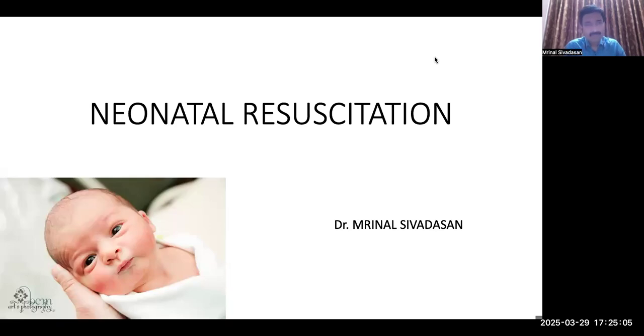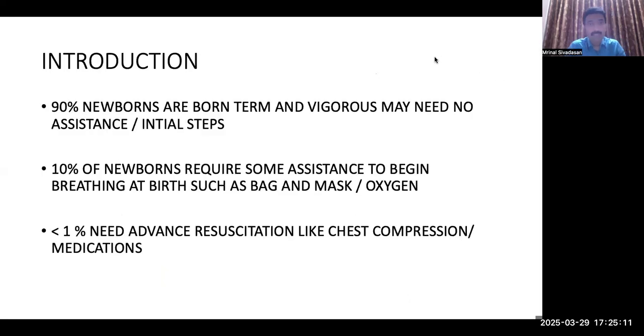Hi, welcome. In this video, we will learn about newborn resuscitation: how to resuscitate a baby if the baby is not breathing at birth.